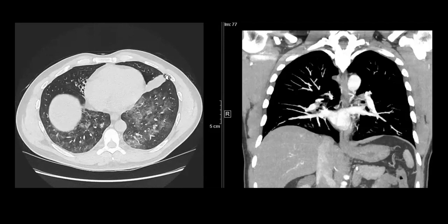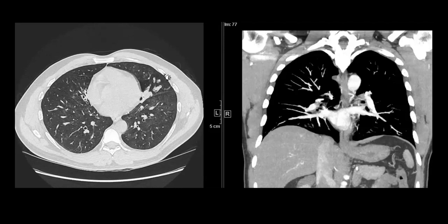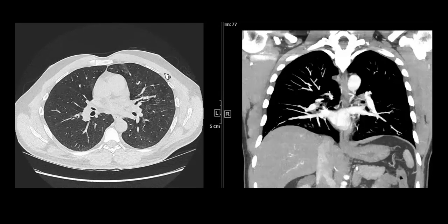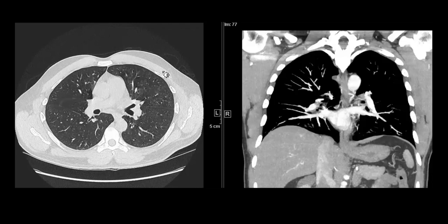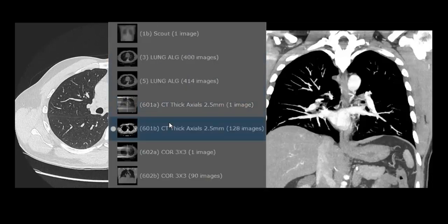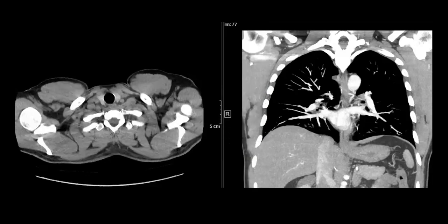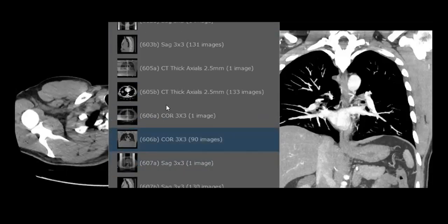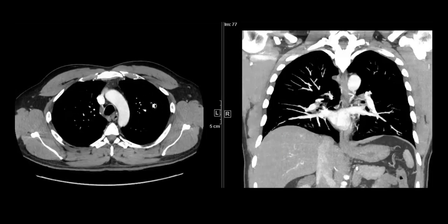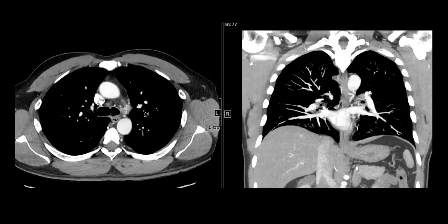That was my mistake — I just gave that differential and didn't think any further. It was my colleague who pointed out that there is one more finding which I should have spoken about. I'll go through the mediastinal windows and let's see if anybody can pick up that finding. We did a contrast CT and I'll go through the mediastinal windows to see if anyone can pick up any additional finding in this case.